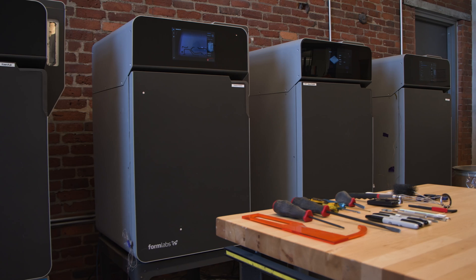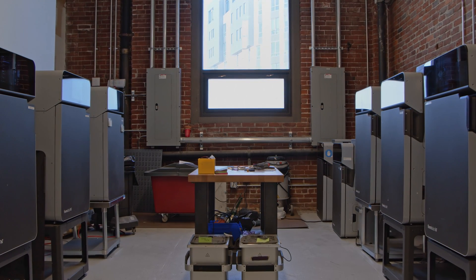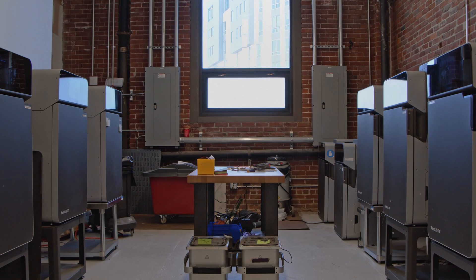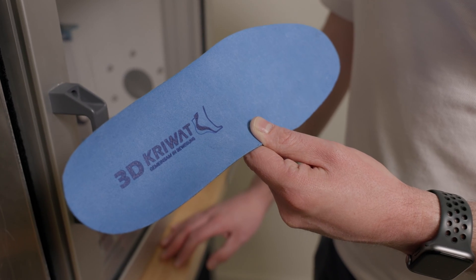By distributing production over a large fleet of affordable 3D printers, you won't see a substantial impact on your production if a printer is offline for routine maintenance. With Formlabs, a key advantage is risk reduction, so you can count on more production uptime and consistent high-quality results.